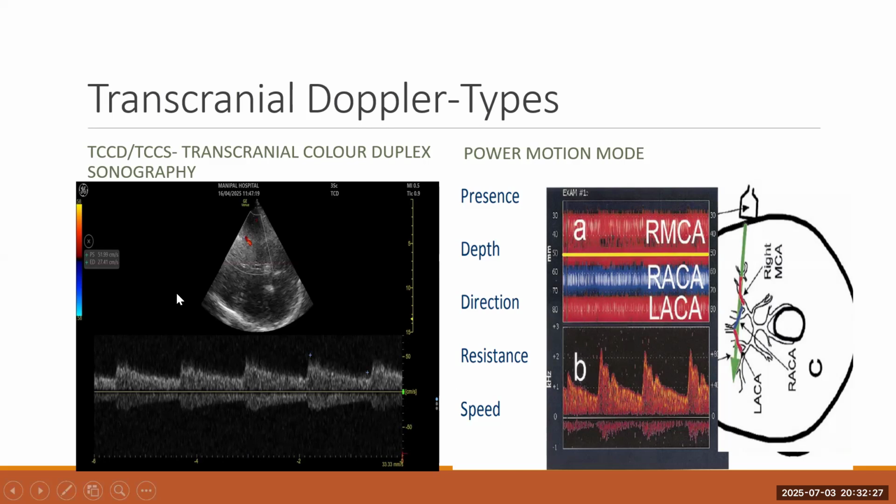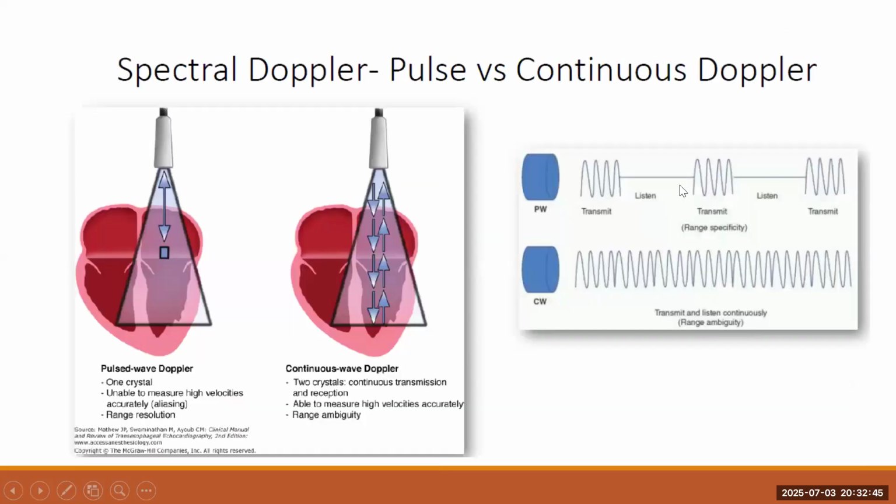Whereas the non-imaging Doppler is not an image, as the name itself indicates. We identify the vessel based on the depth of insonation, and it is more feasible for continuous monitoring. It's just a difference in mode, and it may not be helpful in B mode ultrasonography, but it serves all other purposes well enough. As for the type of Doppler, there are two types: pulse wave and continuous wave. The pulse wave Doppler emits in pulses, whereas continuous wave does it in a continuous fashion.